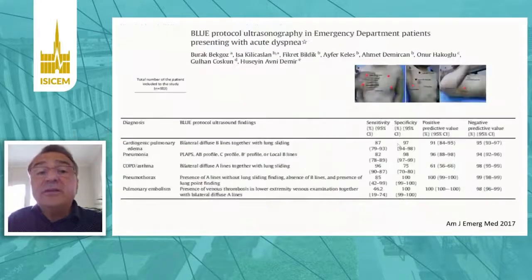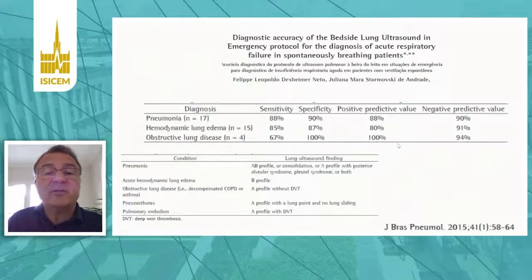Many different studies confirmed that the Blue Protocol is really useful at the emergency department with patients presenting with acute dyspnea. This study included 383 patients. You see that the specificity is very high again, except for COPD patients, and the sensitivity is high, except for pulmonary embolism. Another study demonstrates again that the specificity and sensitivity are high, except for the sensitivity in COPD patients.